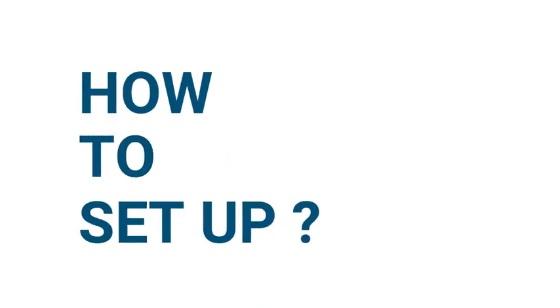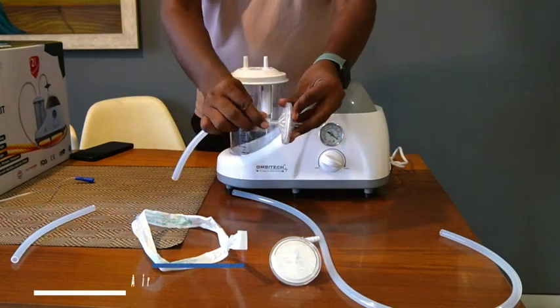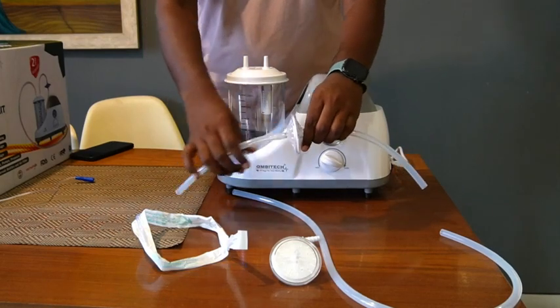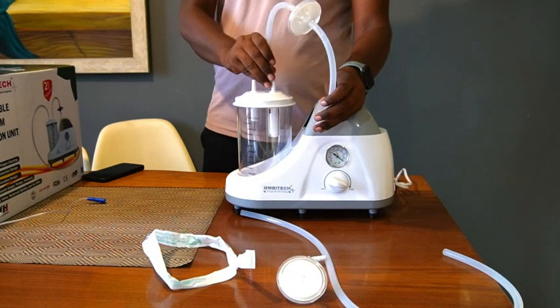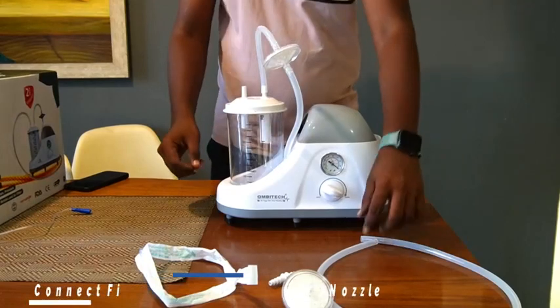Let's look at how to set up the Ambitech Portable Phlegm Suction Unit. Begin by connecting the two short silicone tubes to the two ends of the air filter. Connect one end of any of the short tubes to the vacuum or out nozzle of the suction jar. Connect the other short silicone tube to the overflow valve connector of the reservoir.